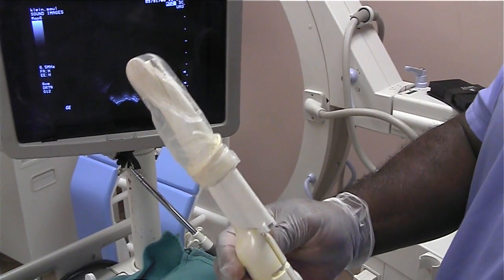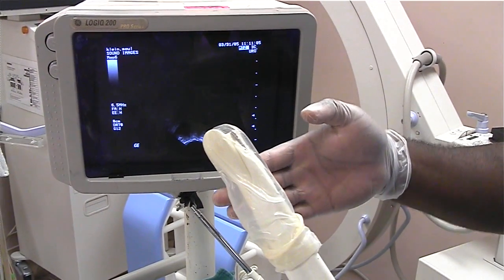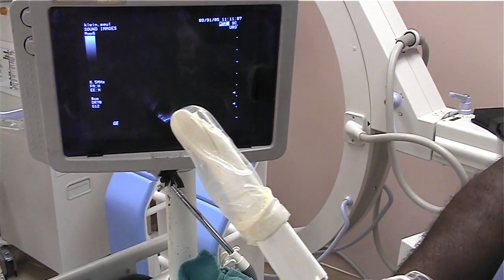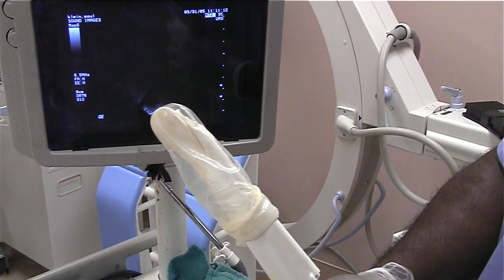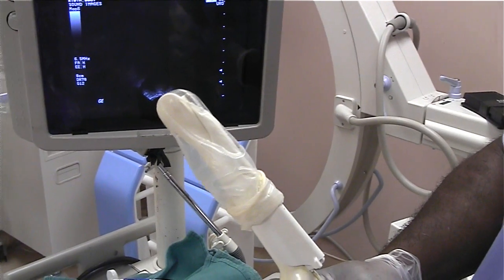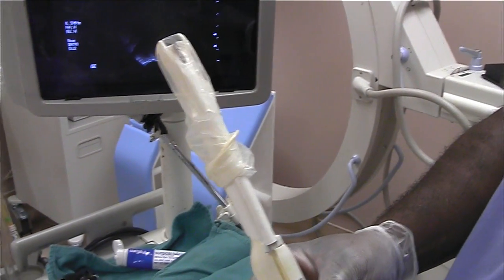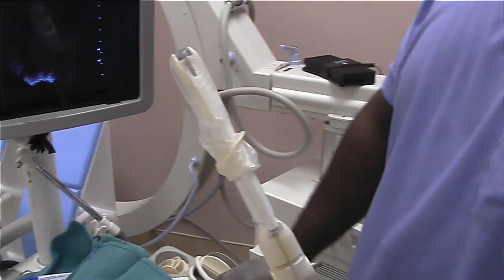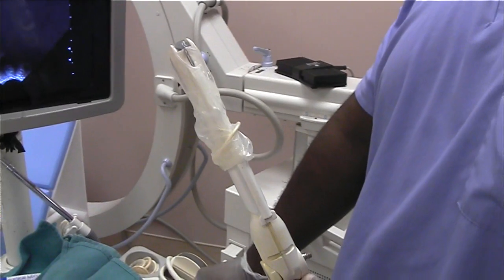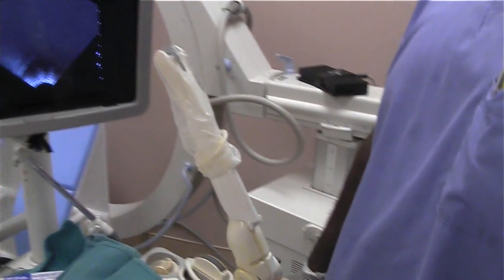It has the capabilities of giving us a transverse and a sagittal image. We do most of our seed visualization and placement using the sagittal image. It's just a little more easier to visualize in that dimension than it is in the transverse, and that way we can hit base and apex and sort of see both at the same time in sagittal.